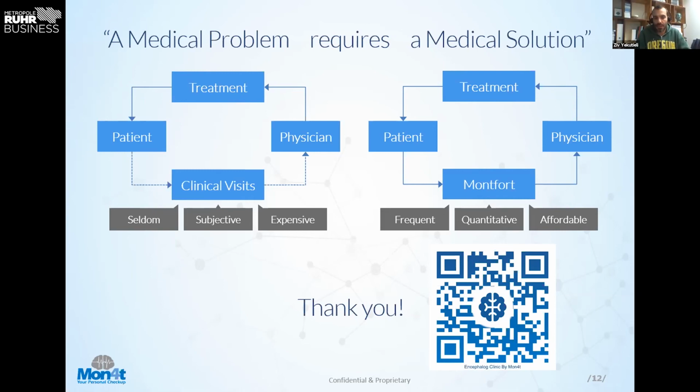Yes, the sensors depend on the kind of test that you want to conduct. If it's a motor test, for the most part we use the accelerometers and gyroscope. We also use the touchscreen for cognitive tests. We use the microphone for voice analysis. We use the GPS for affective evaluation, as part of a measurement to evaluate clinical depression and anxiety. So for every digital marker that the physicians need, we know which sensor to use in order to obtain this information.